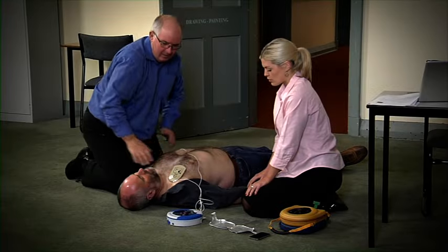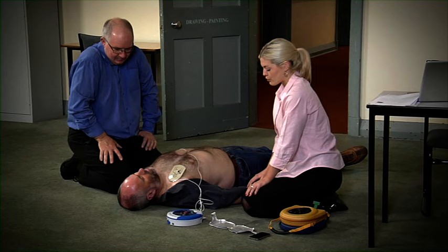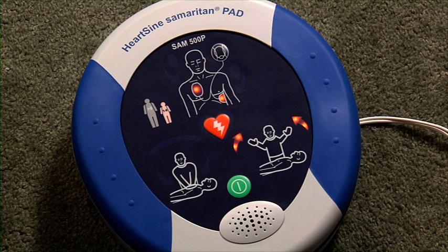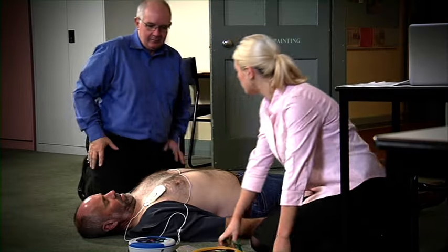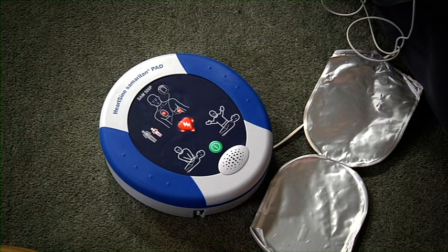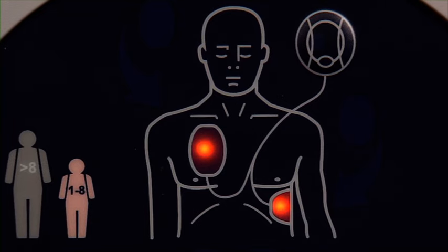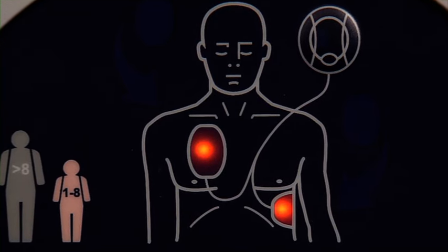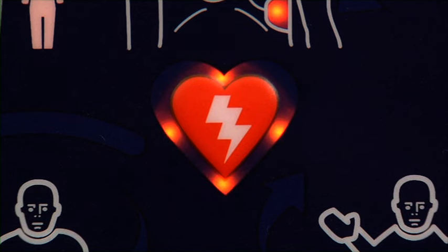Stop CPR. Assessing heart rhythm, do not touch the patient. Analyzing, do not touch the patient. Stand clear of patient. Shock advised. Press the orange shock button now. Shock delivered. The Samaritan 500P will only shock the victim if it determines that a shock is required, so there is absolutely no possibility of accidentally delivering a shock.